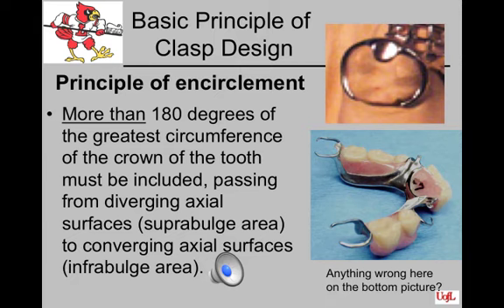The length of the clasp arm also affects the flexibility of the clasp arm. In all reality, we usually place the arms from the beginning area of the tooth to the opposite line angle of the tooth surface. That is, a direct retainer that originates at the mesiofacial surface will extend to the distal-facial line angle of the tooth. The same would be true if a reciprocal component is placed on the opposite side of the tooth. It would not end at the middle of the tooth.